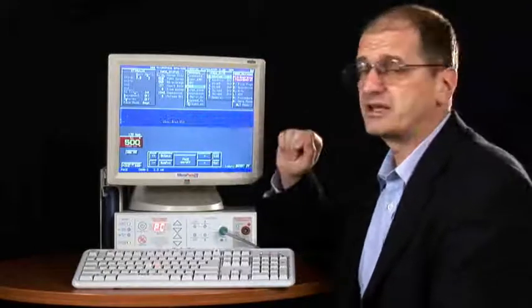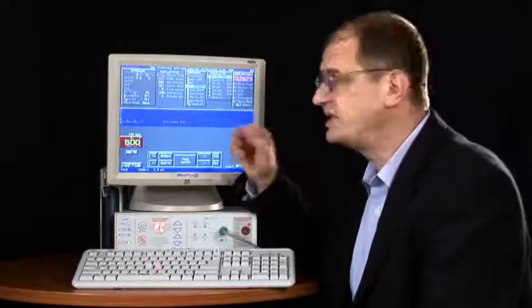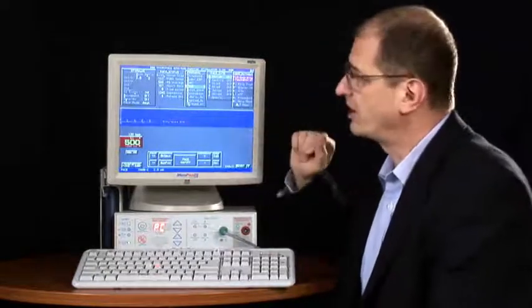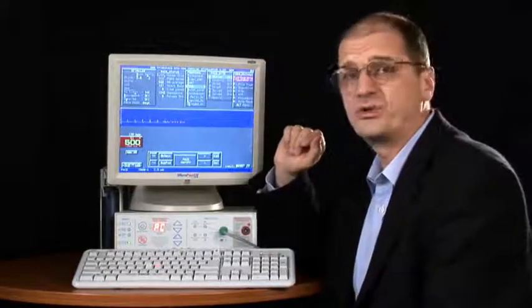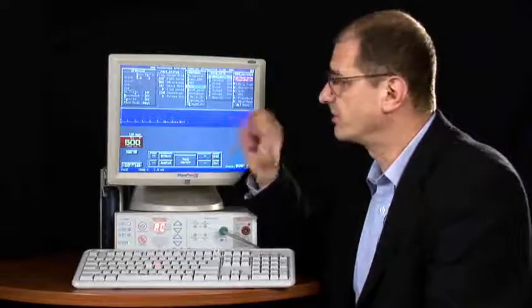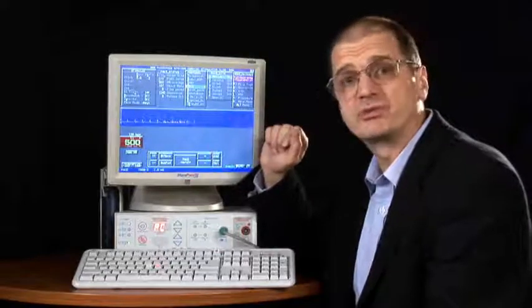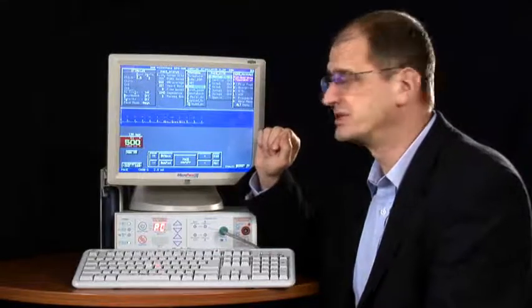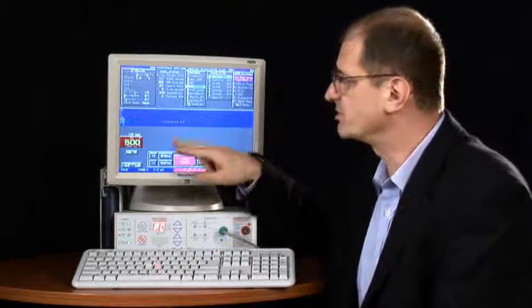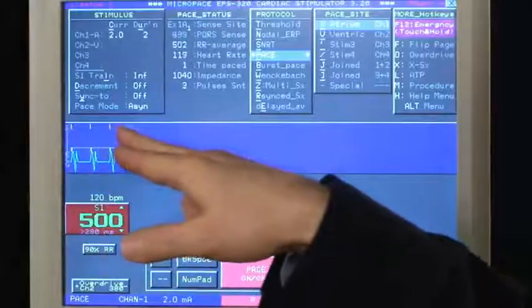In the middle is an ECG graphical bar which shows you the evoked response, as well as the stimuli when you are stimulating, as you can see there.